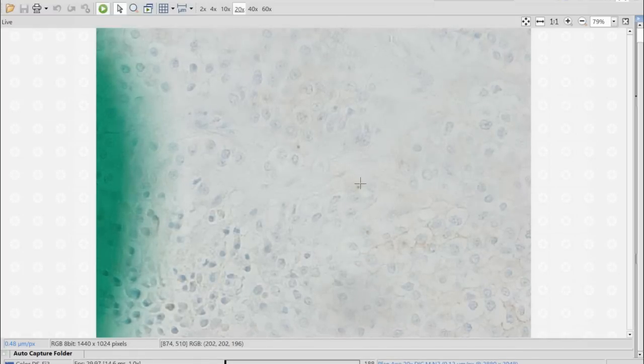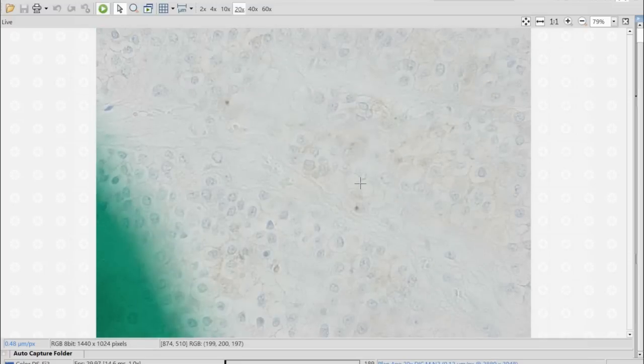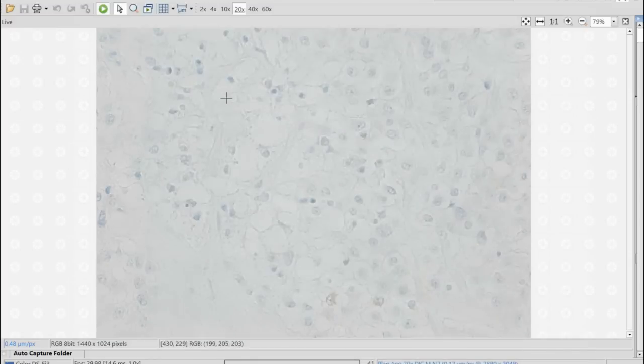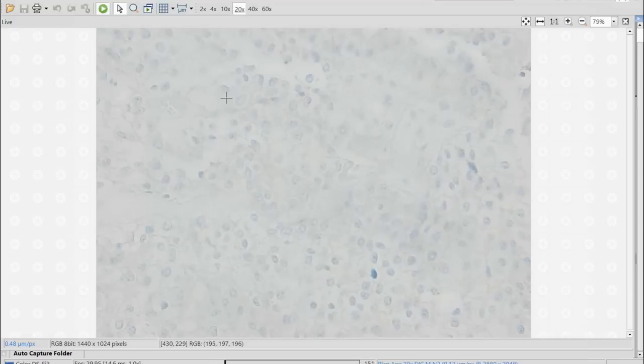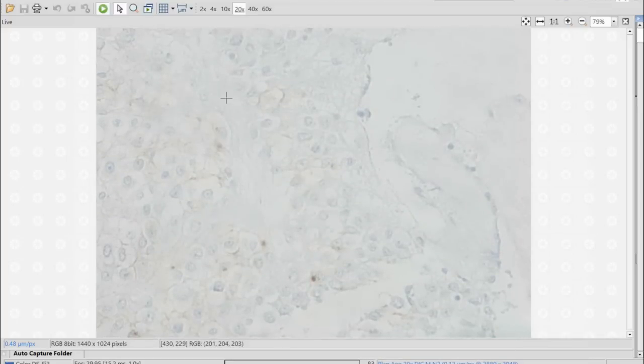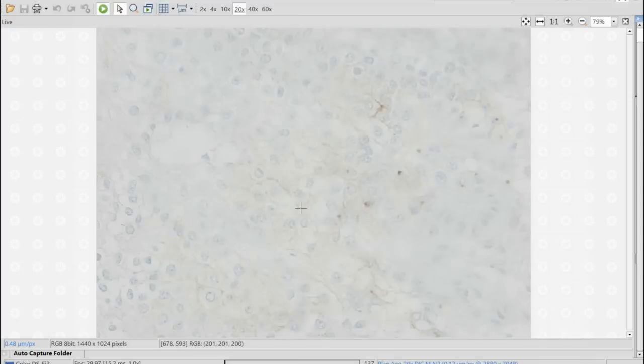Dots, dots. And other dots here. So this is a marker, of course, of ependymomas in the right context. Of course, you want to make sure that everything else is there. But dot-like positivity for EMA is fairly characteristic.